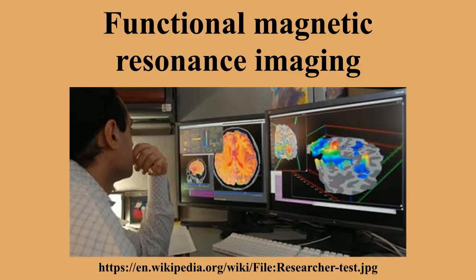They also showed that gradient echo images, which depend on a form of loss of magnetization called T2* decay, produced the best images. To show these blood flow changes were related to functional brain activity, they changed the composition of the air breathed by rats, and scanned them while monitoring brain activity with EEG.